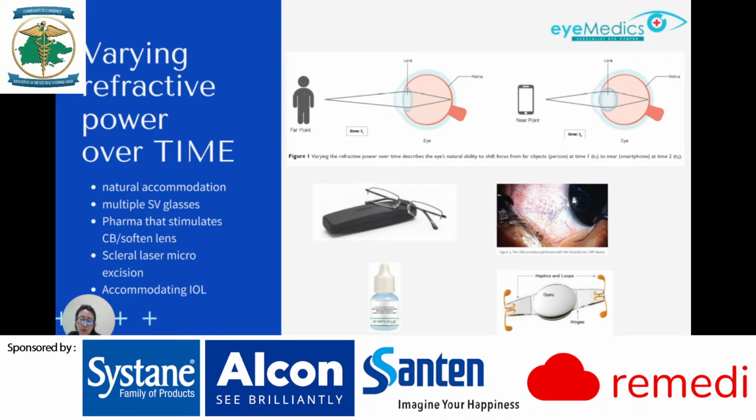Another pharmaceutical option dissolves disulfide bonds in the lens, returning the lens to a more flexible state, thereby allowing for natural accommodative ability. Other options such as laser options include scleral laser microexcision, which uses lasers applied to increase the scleral plasticity and compliance of the scleral tissue to facilitate contraction of ciliary muscles.